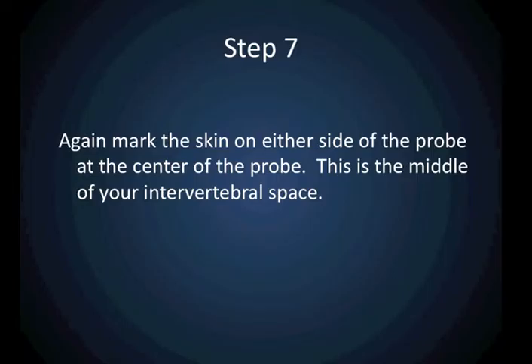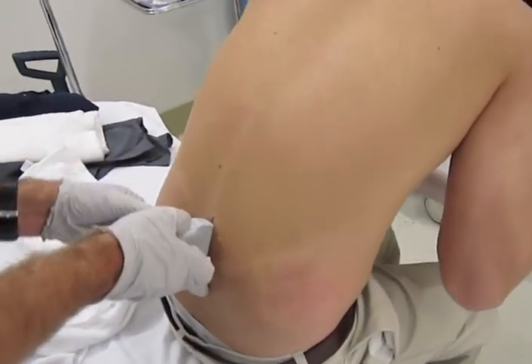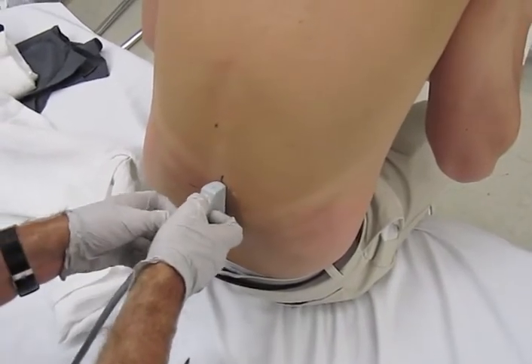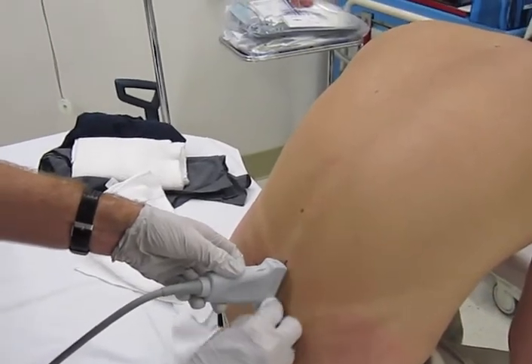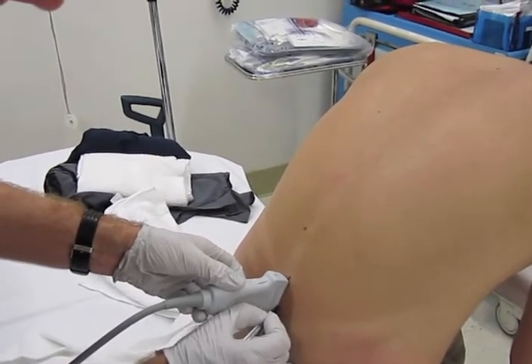Once you have an appropriate image, you are now going to mark the skin on either side of the probe again, as you did before. These marks should be right in the middle of the ultrasound probe on either side of the probe. When you remove the probe, these lines will now indicate where the intervertebral space is.